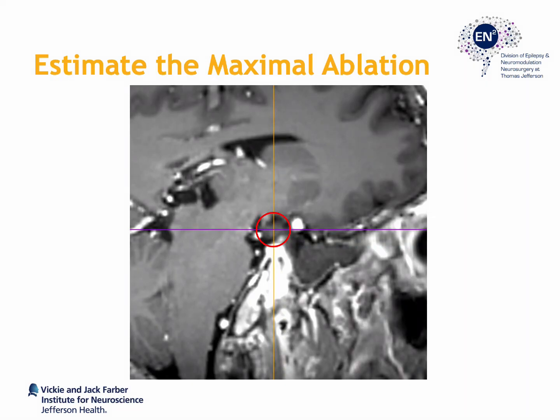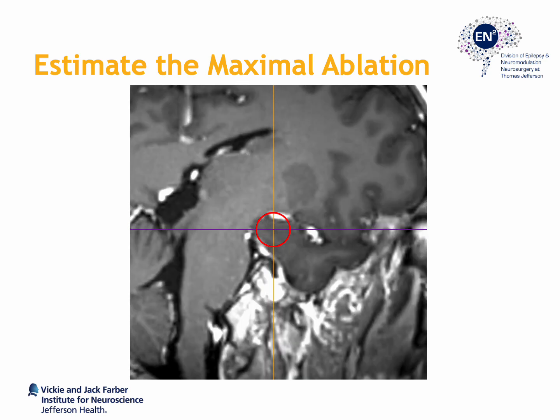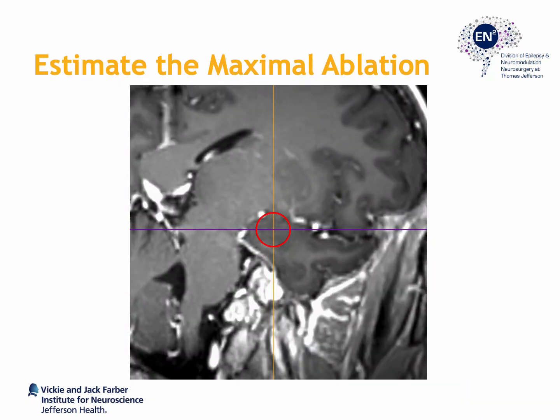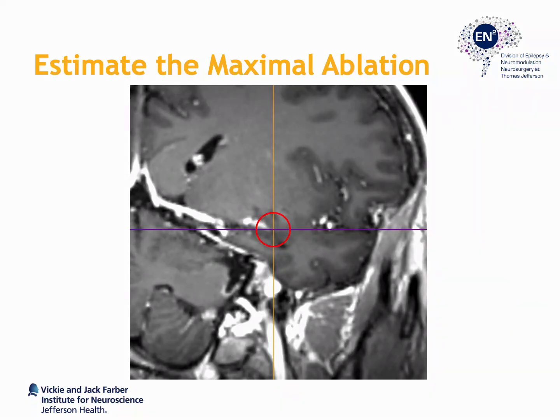I find it helpful to estimate the structures that will be ablated with this trajectory, and we can also predetermine the ablation diameter. Although the system is capable of larger ablations, for this trajectory ablations in the 10–12 mm diameter range are typically adequate. As you can see, it covers the mesial structures and the piriform cortex. We do not want to extend the ablation too far, as doing so would result in significant ablation of the temporal stem. It is also important to predetermine the ablation length, which for this trajectory is typically on the order of 15 mm.